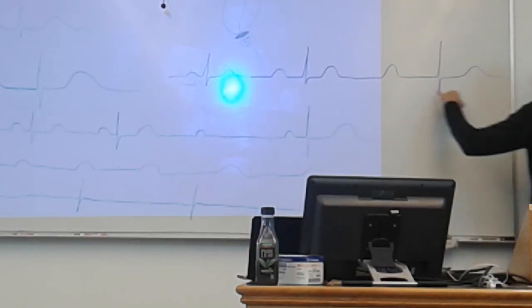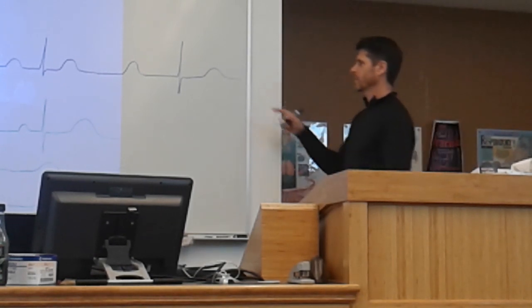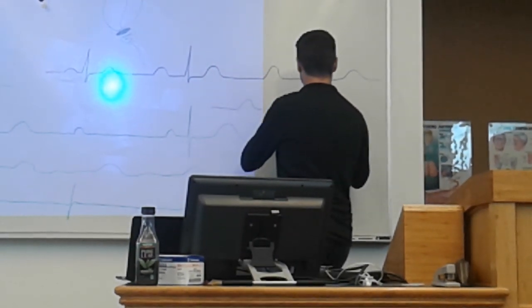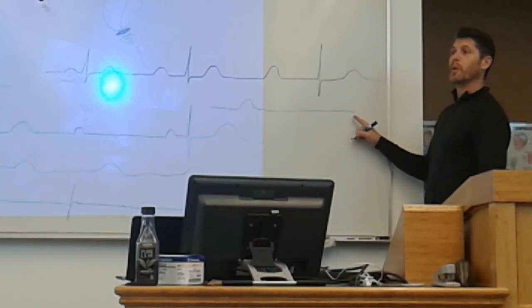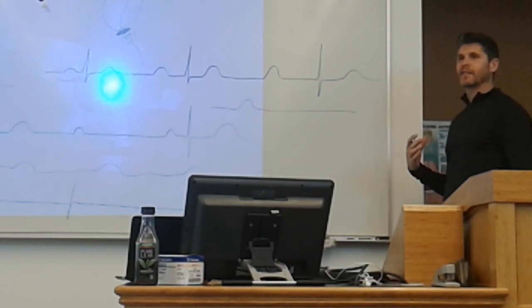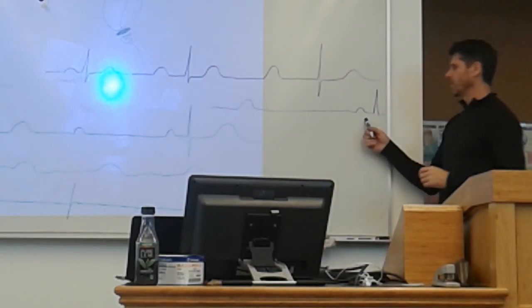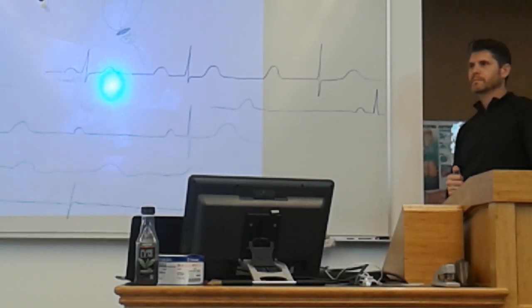And then the next time it comes through and fires, everything was in refractory, so the AV node didn't fire at all, and you lost the QRS complex. I'm going to come down to the second line. So the next time it fired, there was nothing. Does that make sense? But because there was nothing, there was time, and time allowed the entire system to be reset. And so everything was brought back to normal again. Make sense? Would you categorize that as regular or regularly irregular?